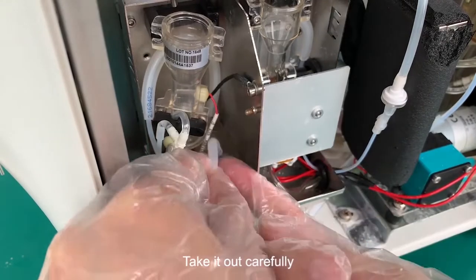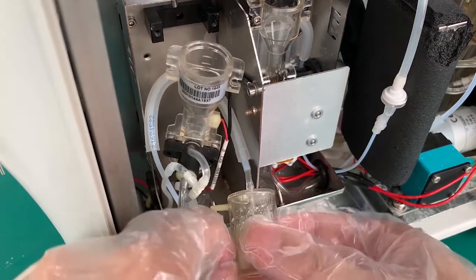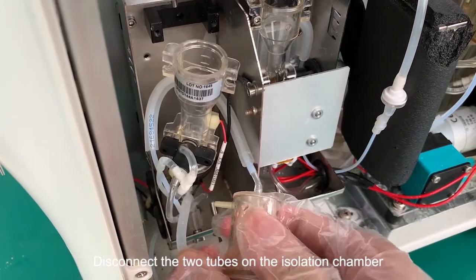Take it out carefully. Disconnect the two tubes on the isolation chamber.